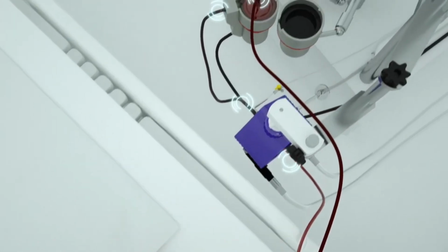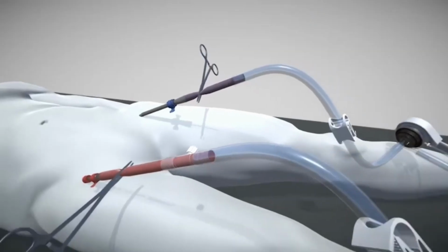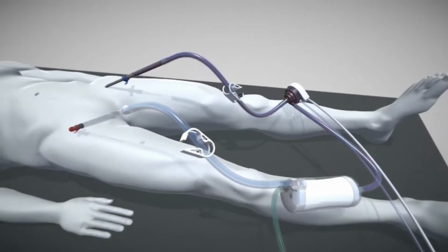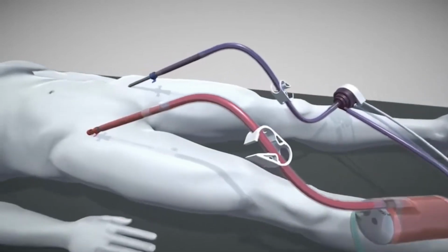Now we discuss veno-arterial ECMO. VA ECMO provides both respiratory and cardiac support to the patient. Here, deoxygenated blood is actively drained through a drainage cannula from the venous circulation and passes through an oxygenator, where CO2 is removed and oxygen is added. Then this oxygenated blood is pumped back into the arterial circulation through a reinfusion cannula.